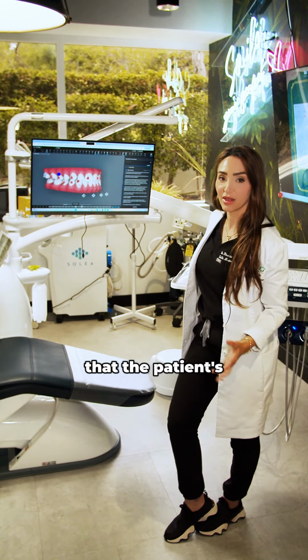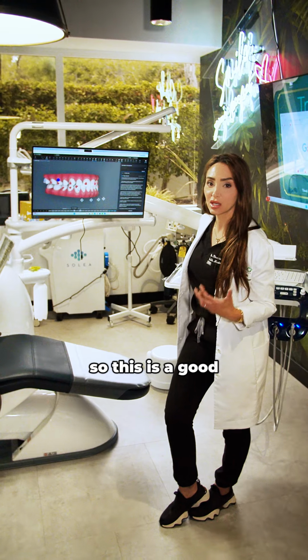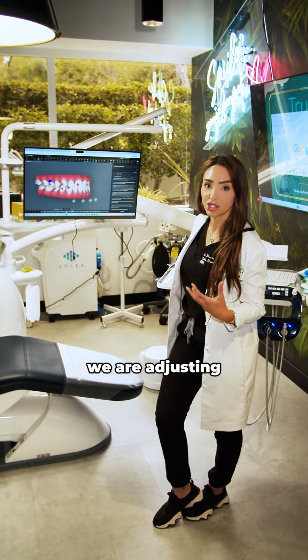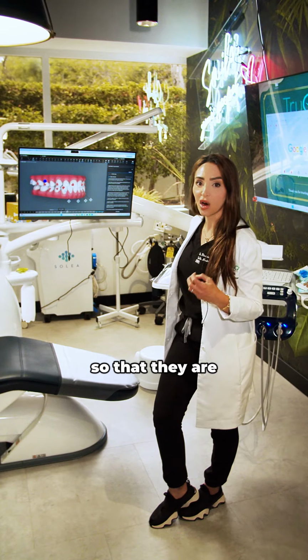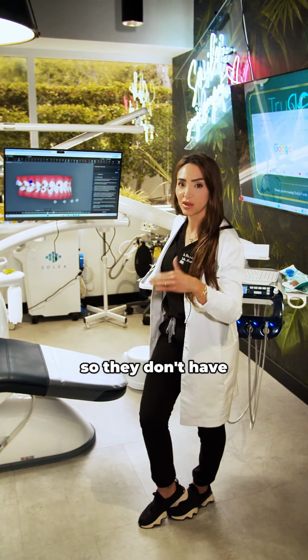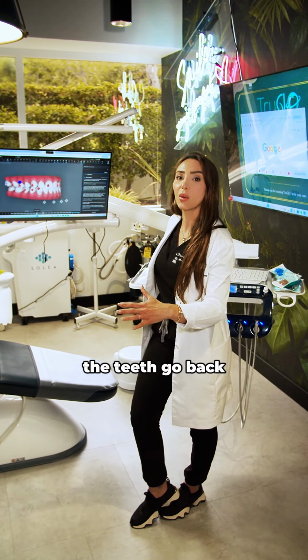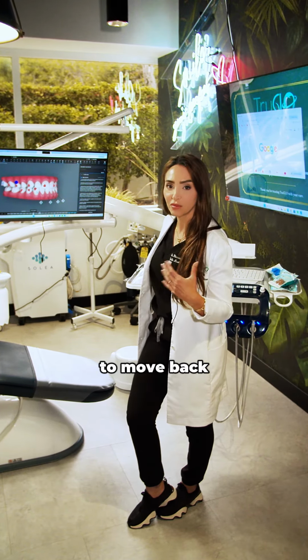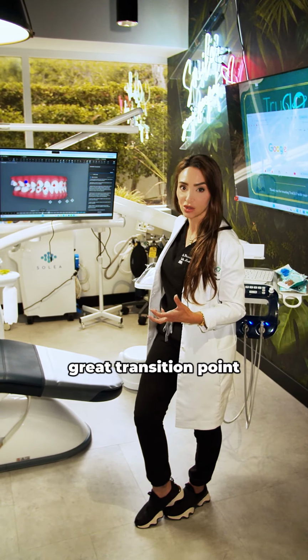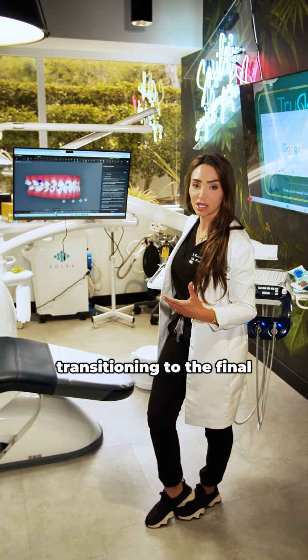So here you see that the patient's teeth are actually edge to edge. So this is a good transition point. This is where we want the patient. And a lot of the time we are adjusting the front teeth so that they are not hitting too hard on the front. And by adjustment, I mean just polishing them so they don't have interference. And slowly you're gonna start to see the teeth go back and move back. So she went from a complete underbite to this edge-to-edge position, which is a great transition point. And then slowly we're gonna start to see her transitioning to the final.